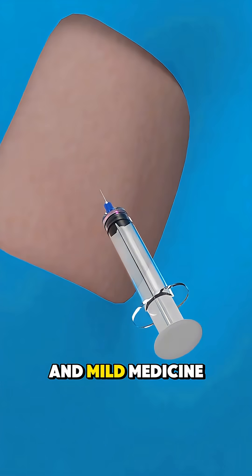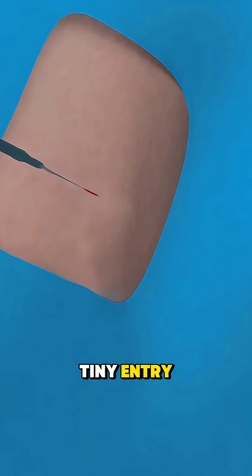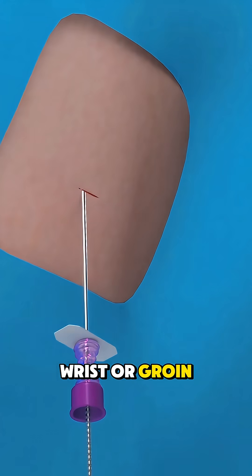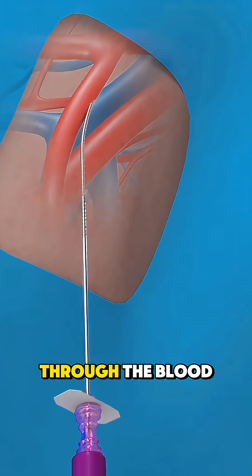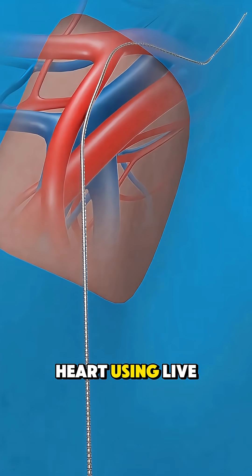First, the patient is given local anesthesia and mild medicine to relax. A doctor makes a tiny entry, usually in the wrist or groin, and guides a thin, flexible tube called a catheter through the blood vessels to the heart using live X-ray.